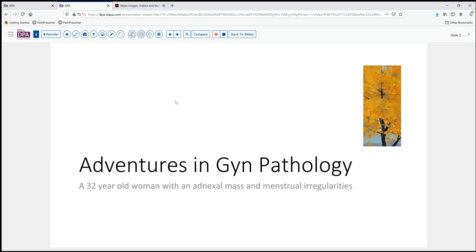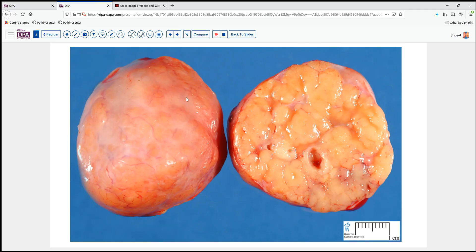Today's case — another GYN case adventure. It's a 32-year-old woman who has had some recent onset of menstrual irregularities, and she's found to have a very sizable mass in one adnexa. Surgical exploration is indicated, and this is a section showing you the gross image of this lesion. You can see it has a pale yellow appearance, some fleshier tan tissue, fairly lobulated with some dilated areas, maybe with a follicle or two-like structure, and it pretty well fills the entire lesion — several centimeters in size.